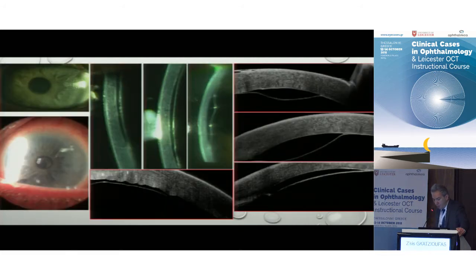And most important is the DMEK keratoplasty, where we need the visualization of the interior surface of the cornea. So these are all cases of Descemet membrane detachment. As you know, DSAEK grafting is producing an interface, and you can easily see the interface on the slit lamp and also assess the margins of the graft, but with DMEK it is different, especially if you have patients with very advanced bullous keratopathy.